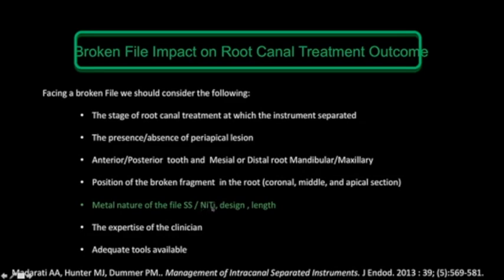The nickel titanium file, because it's flexible and because it is NiTi, when you generate ultrasonic vibration on it, the NiTi will tend to heat, and when it tends to heat, it might break. So it's more difficult when you are trying to vibrate a nickel titanium file to move it, and it will tend to break, and we are going to see cases when the NiTi will break.